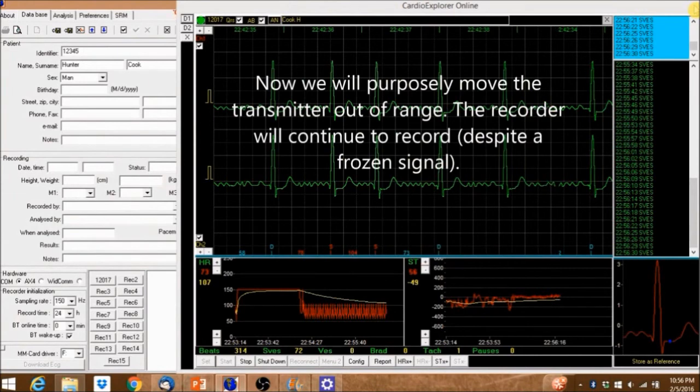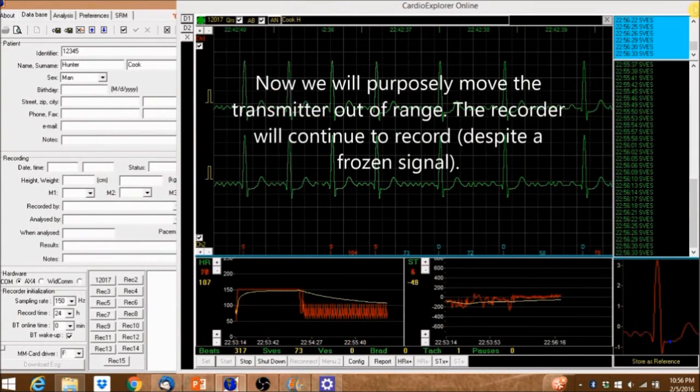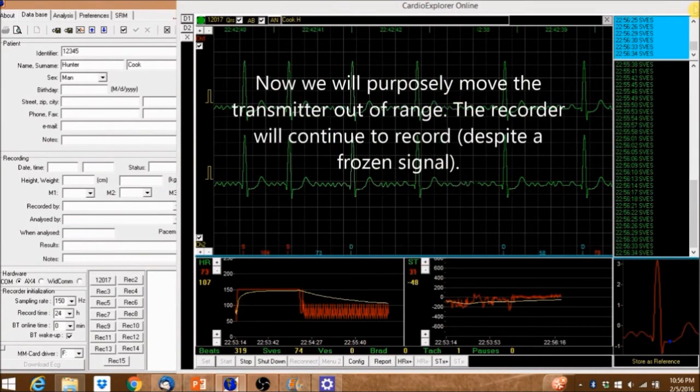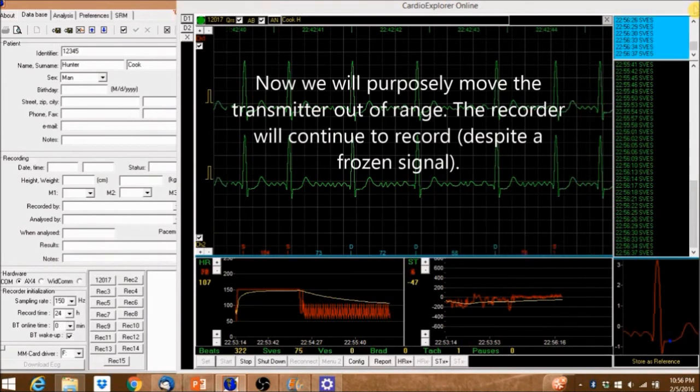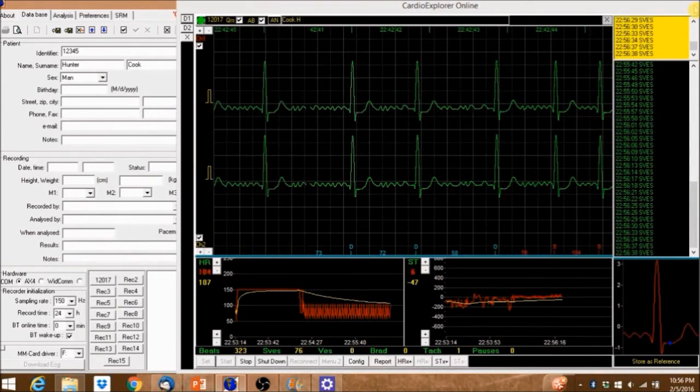Now we will purposely move the transmitter out of range. The recorder will continue to record despite a frozen signal.